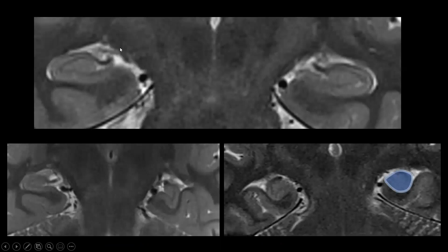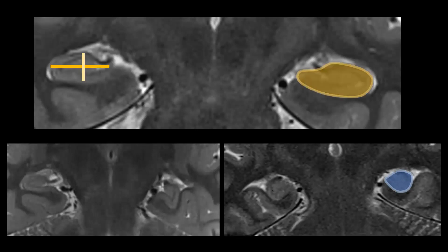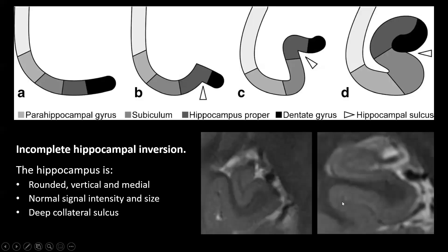Looking at hippocampal morphology, we can see two normal hippocampi that differ in shape. One is pretty wide but not very tall — an ovoid shape. The other has a more globular shape and is about as wide as it is tall. This is called an incomplete hippocampal inversion — basically a variation of the normal hippocampal shape. To understand how this occurs, we need to understand hippocampal embryological development.